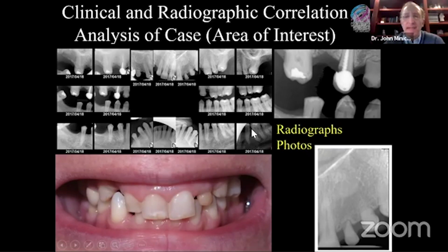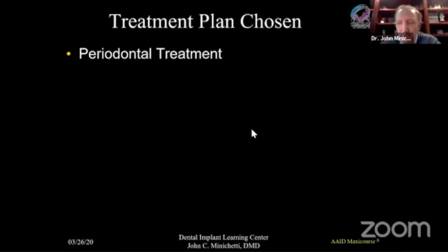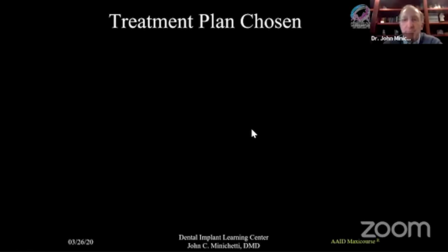And I felt that it might be best to retain these teeth and deal with restoring her other teeth prosthetically to give her the cosmetic results, and trying to keep the budget down too. Because in Anthony's case, fixed detachables, the price range on those are sometimes more reasonable because we're placing fewer implants than this type of patient where we're placing implants in tooth positions and now crowning all of her other teeth. These cases sometimes tend to cost more. And I remember that being one of the discussions.